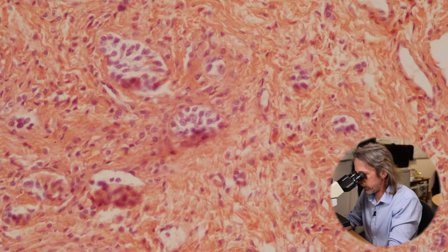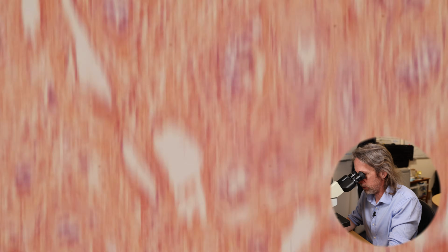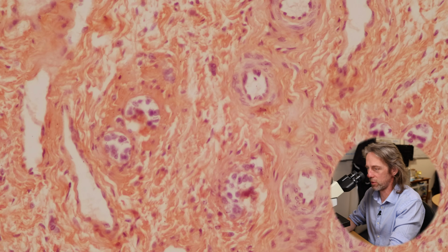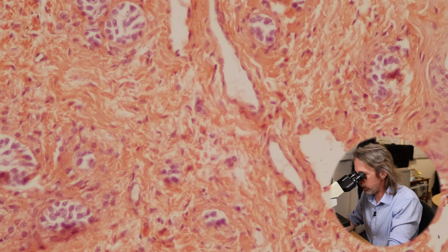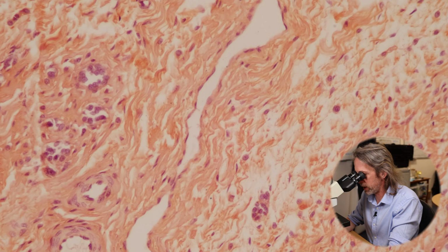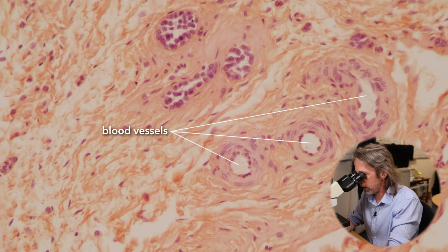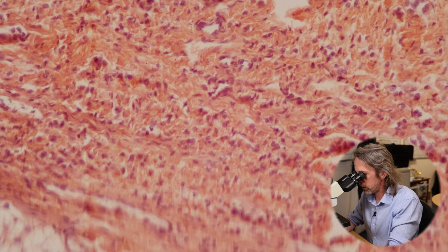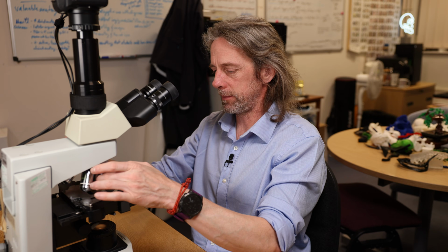We're not going to look at this again later, so if I just pop up to a higher power, this is what the medulla looks like. It's okay, there's a lot of circles in the body, forgive me. But the circles we're seeing here are just your bog standard blood vessels and what have you, right? So that's the medulla and the cortex. On to the interesting stuff.